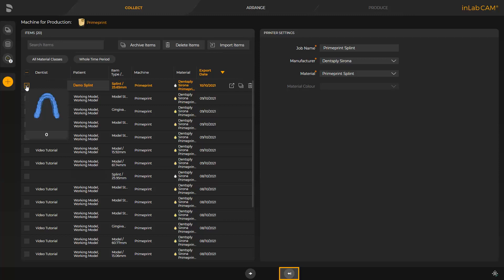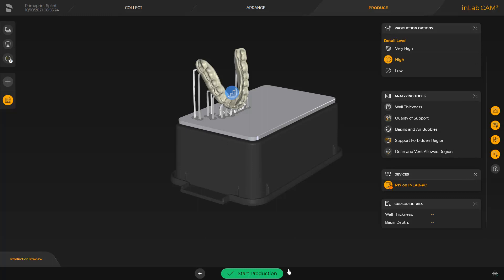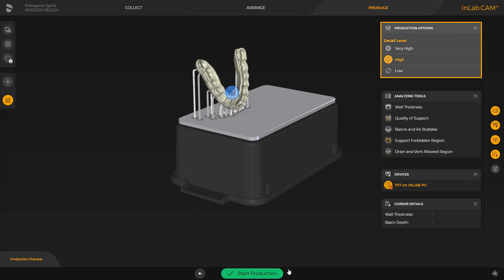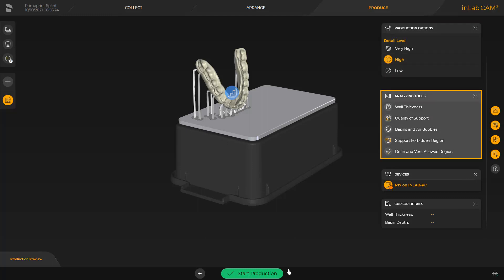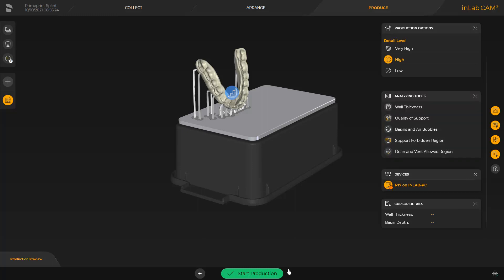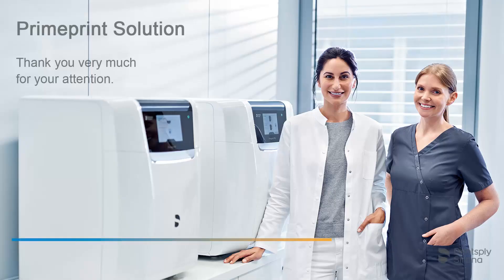We click the double arrow, and can finally modify the detail level in the window under Production Options and analyze the print object with the Analyzing tools. To start printing, we tap the green area labeled Start Production. Thank you very much for your attention. We would like to wish you every success when working with PrimePrint Solution.